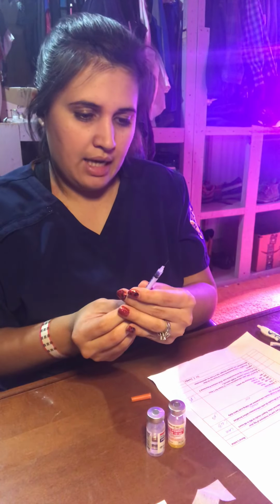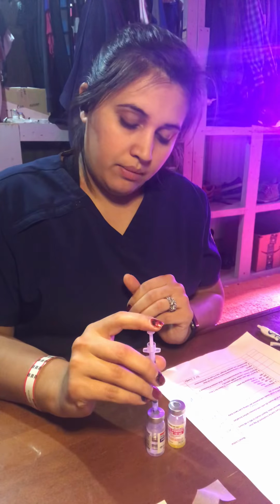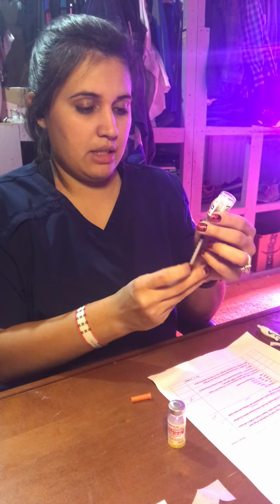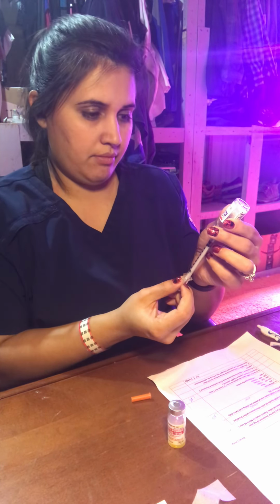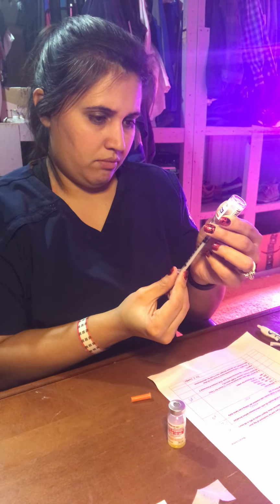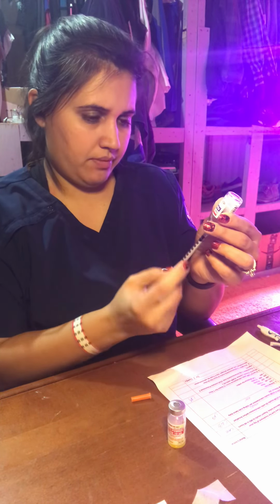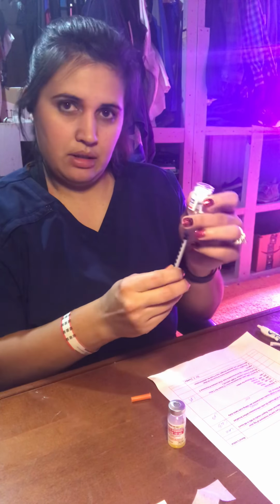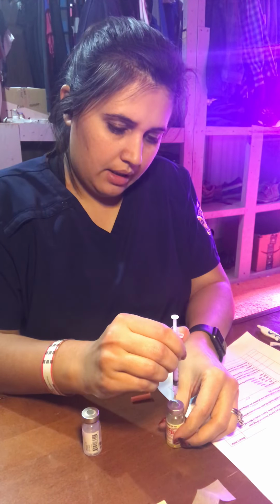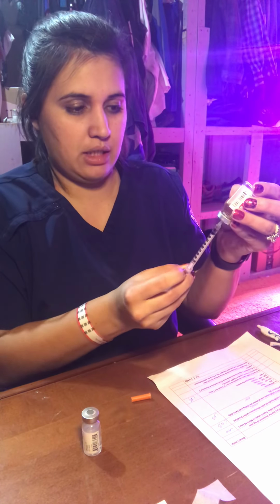Remove, get 10 units of air, insert that into the regular insulin. Pull the regular insulin up, grab 10 units. Okay, get any air bubbles out. All right. And now into the NPH and grab 20 more, which will give me 30 units.